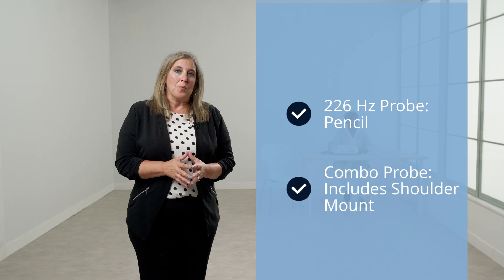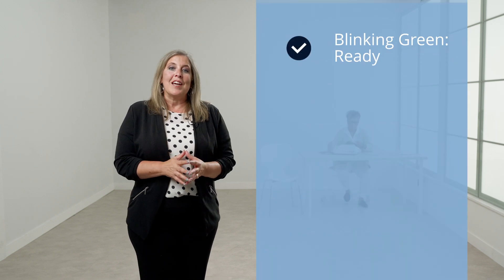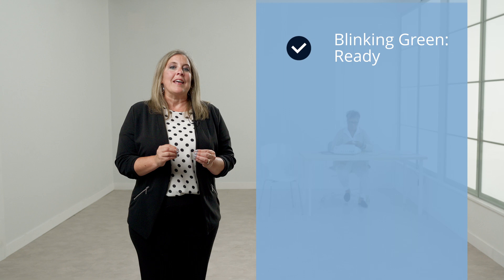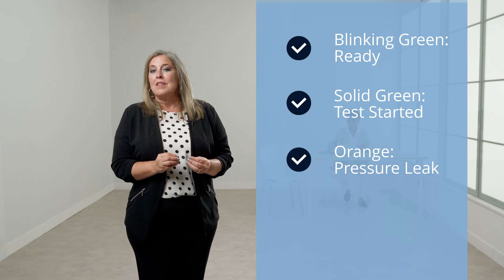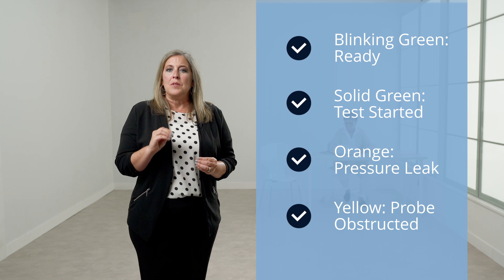There are two probe types for tympanometry. The 226 Hertz probe is the standard probe and resembles a pencil. A combination probe with a shoulder mount will be provided for a version that includes a 1000 Hertz probe tone. Instead of seating the probe tip deep in the ear canal to obtain a seal, the probe tip should be held at the entrance of the ear canal. There are indicator lights on the probes. If the light is blinking green, the GSI 39 is ready to begin a test. If the green light is solid, the test is successfully started and in progress. If the orange light is illuminated, a pressure leak has been detected. If the light is solid yellow, the probe is obstructed and should be removed, inspected for debris, and reseated at the entrance of the ear canal. If there are no lights, the test is complete.